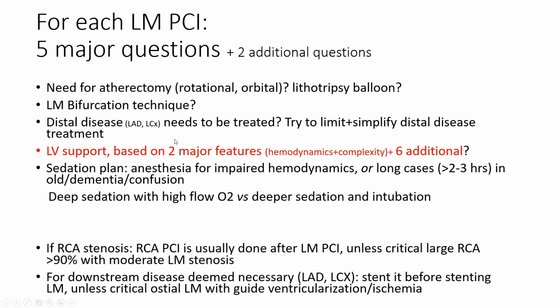Also, you know, you can always stage it. Try not to do too much so you can limit your ischemic time, especially if you don't want to do LV support. So the other feature is LV support, which is influenced by those other features, as I explained, the 2 major and the 6 additional. Then the sedation plan that I'm going to use in this patient, which will also influence what LV support you use.